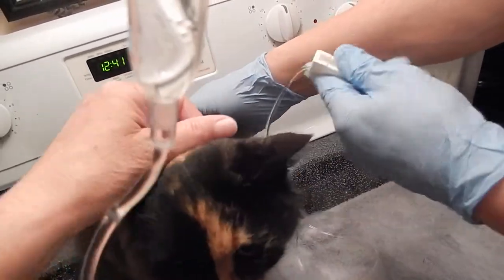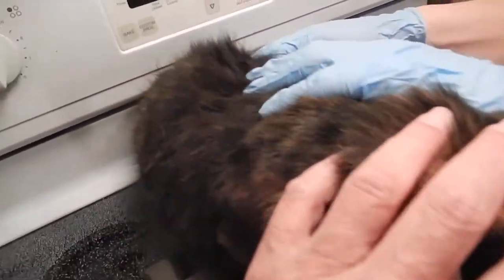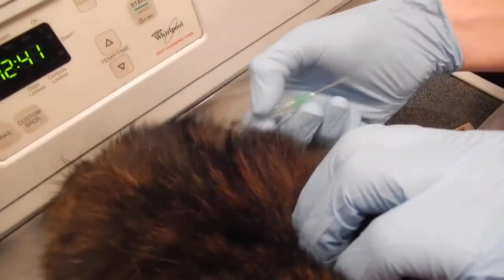I'm going to turn it off so it doesn't drip all over. And then I'm going to pull out the needle. There it is. I'll put the cap on and that's it.